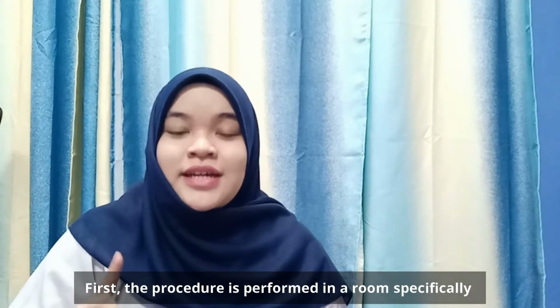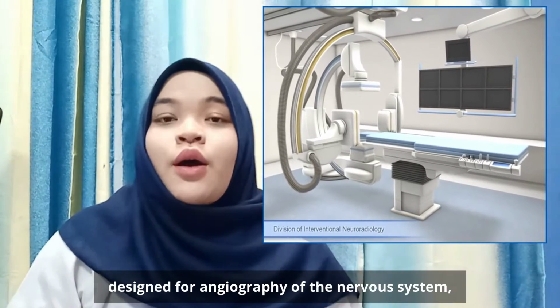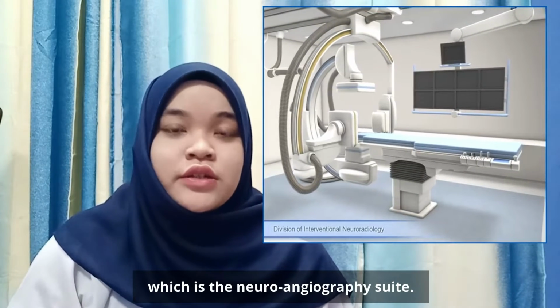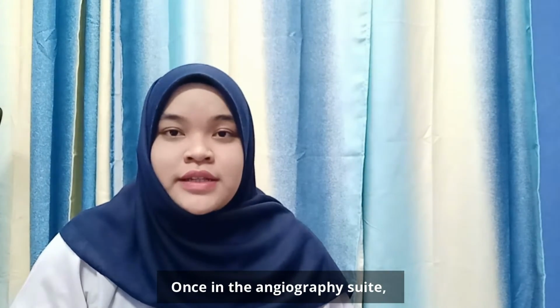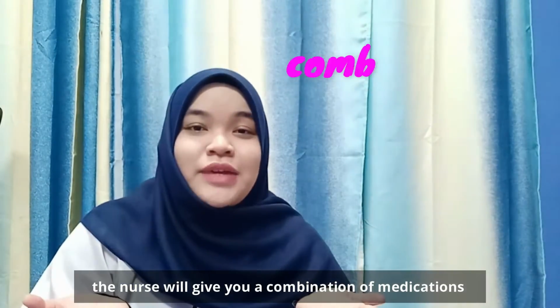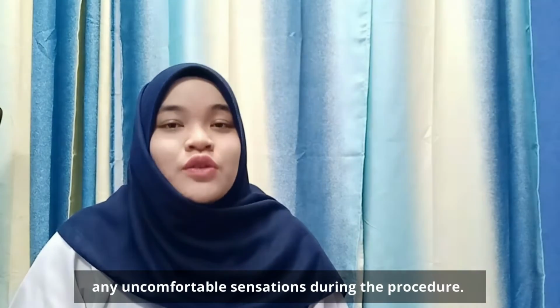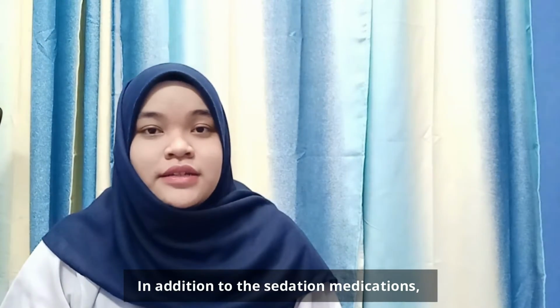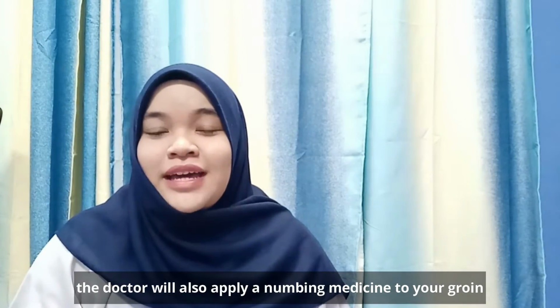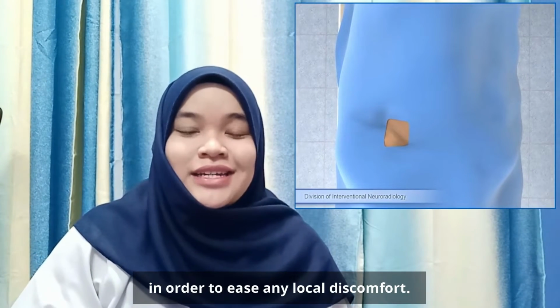First, the procedure is performed in a room specifically designed for angiography of the nervous system, which is the neuroangiography suite. Once in the angiography suite, the nurse will give you a combination of medication that will help you relax and remove any uncomfortable sensation during the procedure. In addition to the sedation medication, the doctor will also apply a numbing medicine to your groin in order to ease any local discomfort.